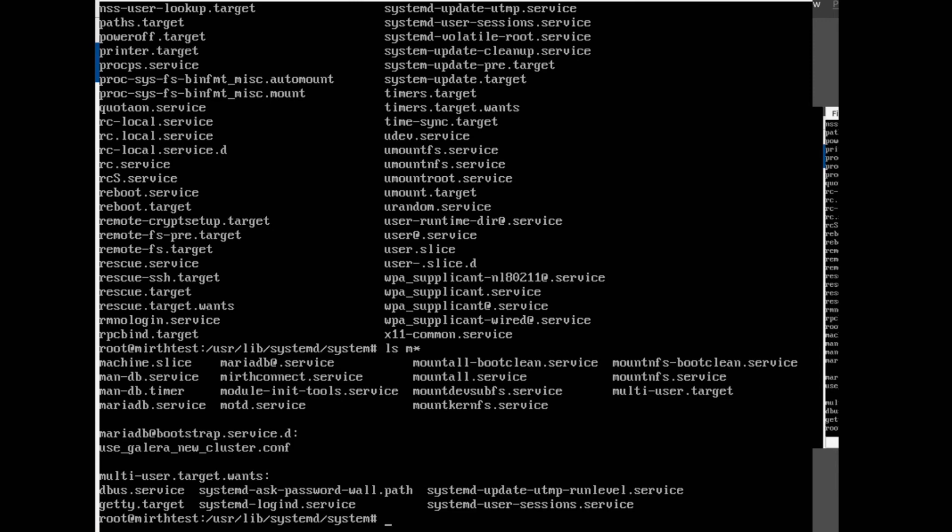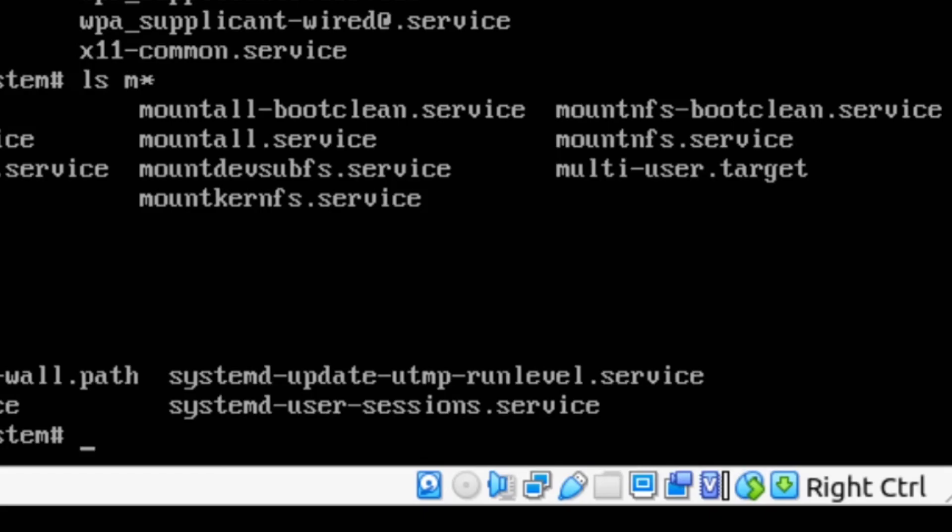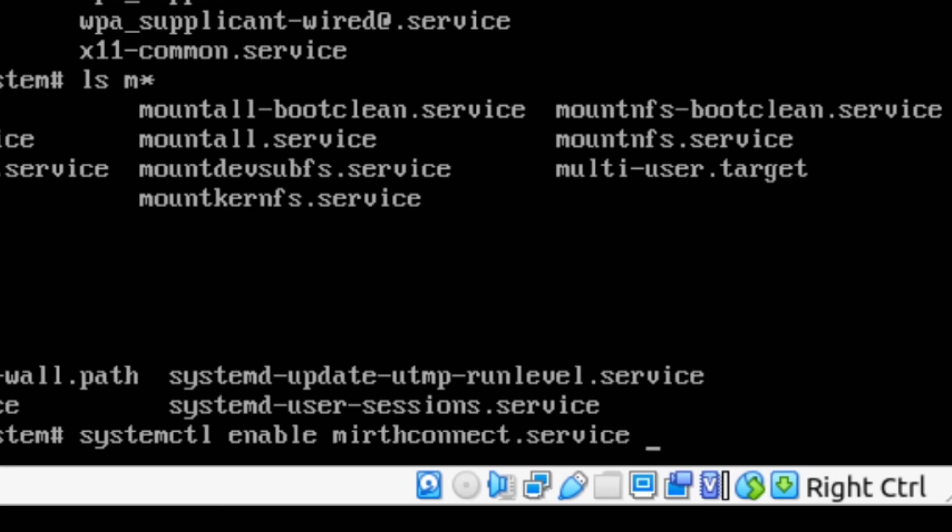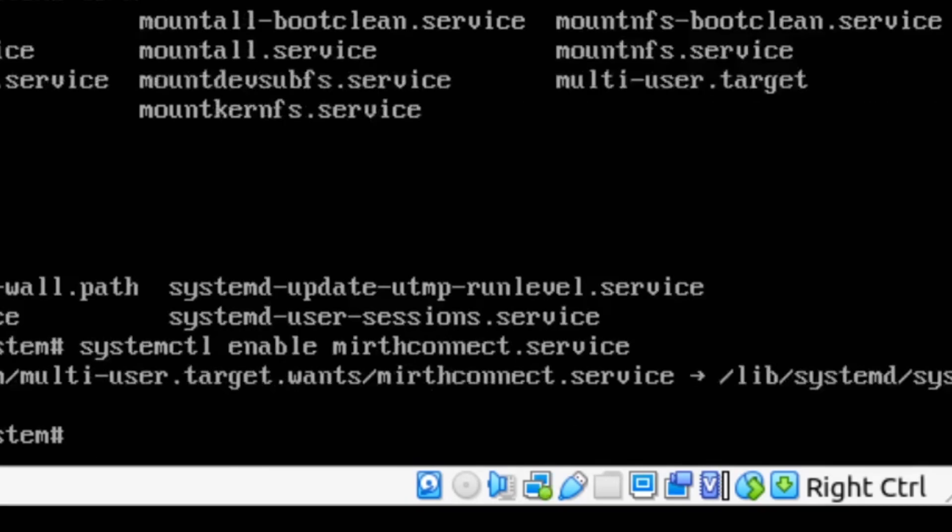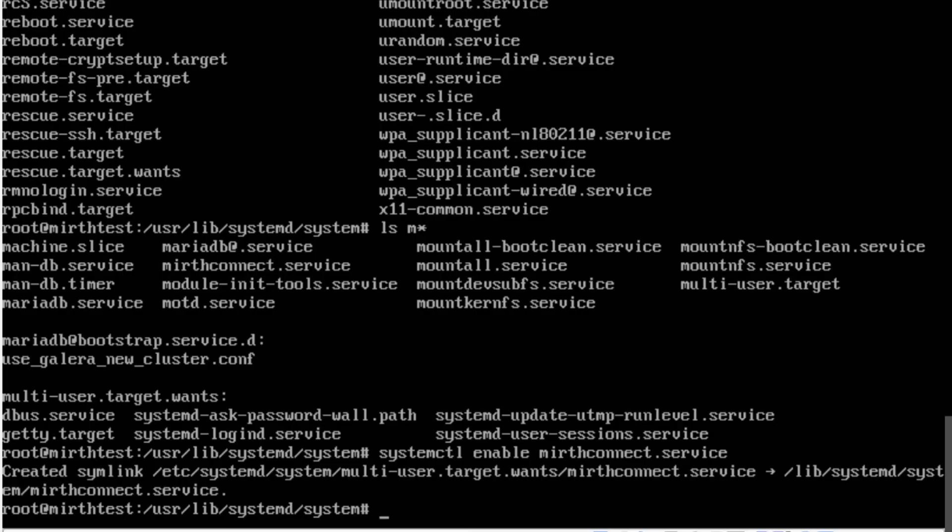At this point we want to go ahead and type in systemctl enable then mirthconnect.service. And what that will do is it will tell systemd that we have the file ready to go and it's ready to be run and we just want to tell systemd that we want to start running this when the system starts.